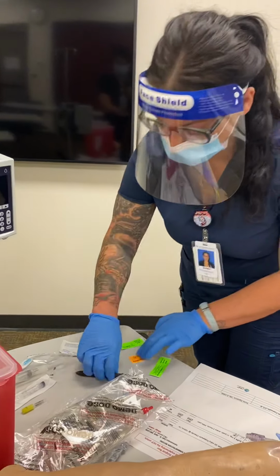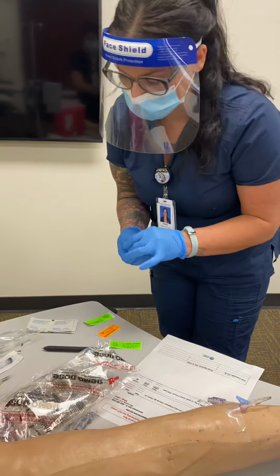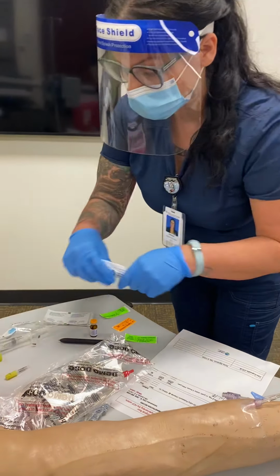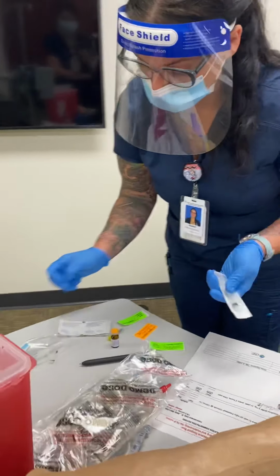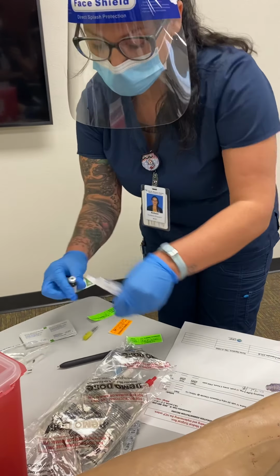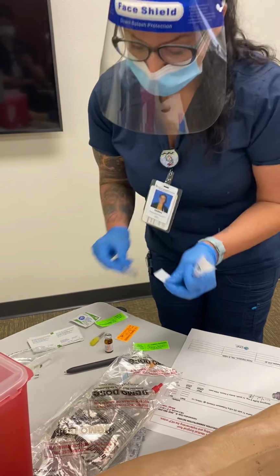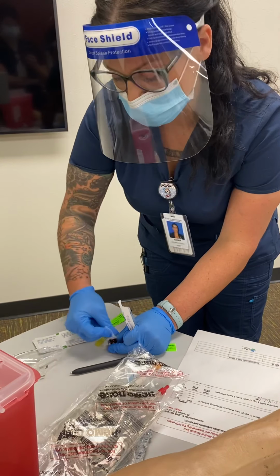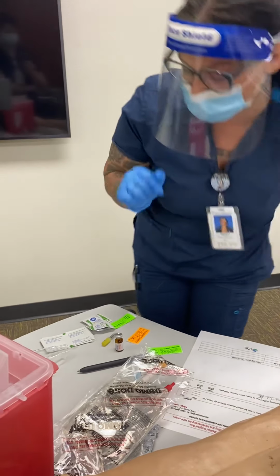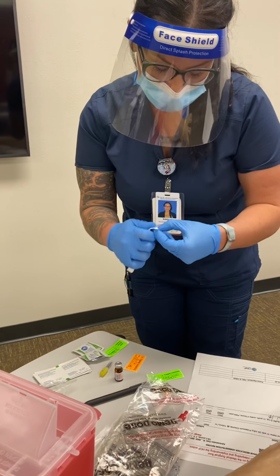Okay, so I'm going to get my morphine ready first. I'm going to grab that and do my second med check. Everything matches. I will get my syringe, my drawing needle, and I'm going to pop the cap. You're going to clean this hub for 15 seconds. For video purposes, that was 15 seconds. While that's drying, prepare my syringe.